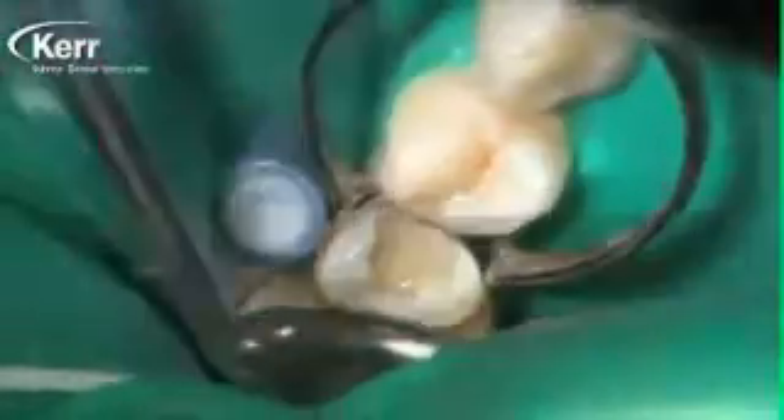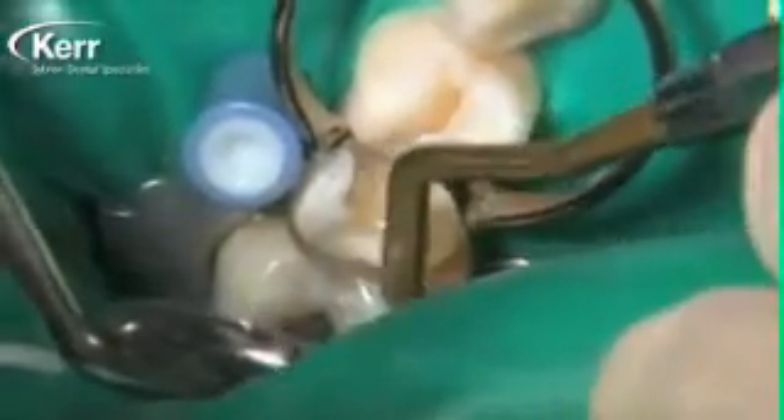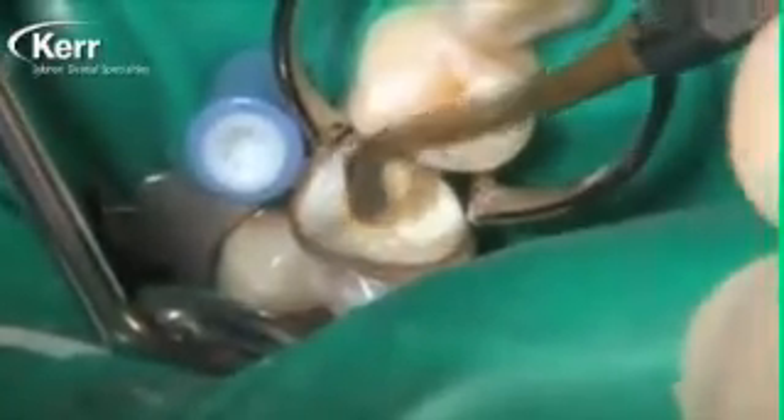Because of the size of the hole from the decay that was in there, I'm going to place a second layer on top of that first layer. You'll notice that we don't need to agitate it with the brush because we've already got Dyad Flow covering all the tooth structure on the inside of the cavity preparation. We just place a little more Dyad Flow and then cure it again for 20 seconds. At this point we've got our Dyad Flow covering the entire tooth structure, bonded into place.